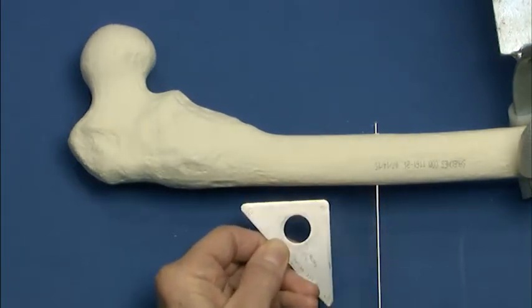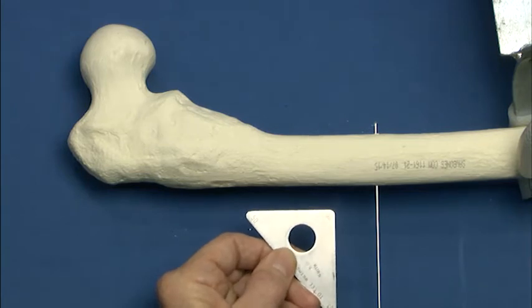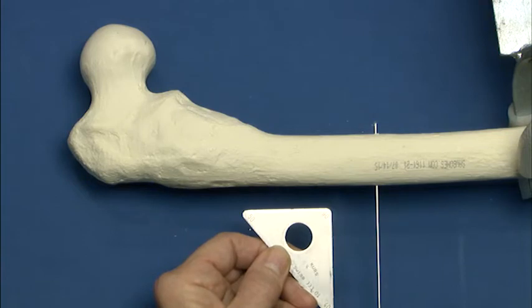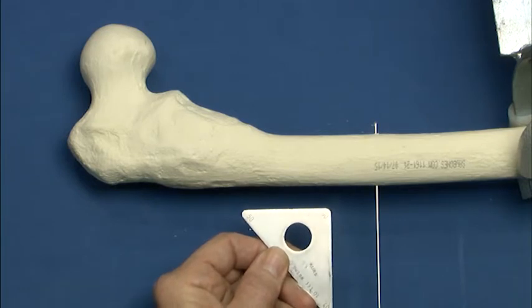Okay. Now, at this point, I'm going to transfer that reference proximally, and I'm going to place it at the level of the initial transverse cut for two reasons. I'm going to use it ultimately for the cut, and secondly, I want it closer to my reference for the 20-degree deviation that we need for placement of the guide reference wire for the seating chisel.